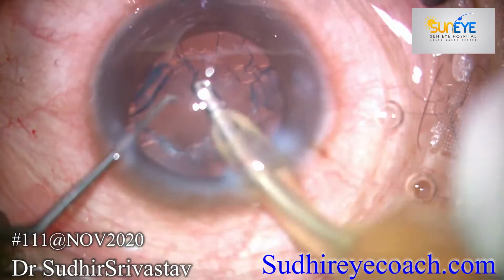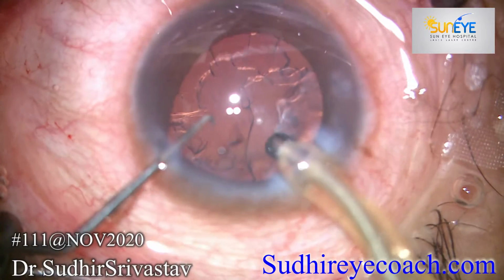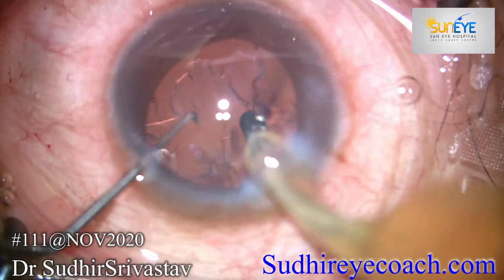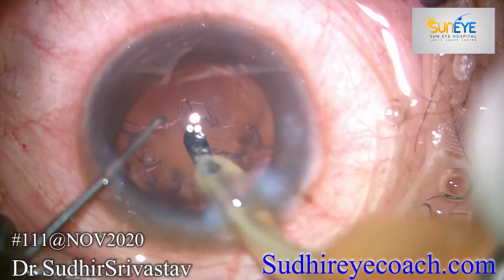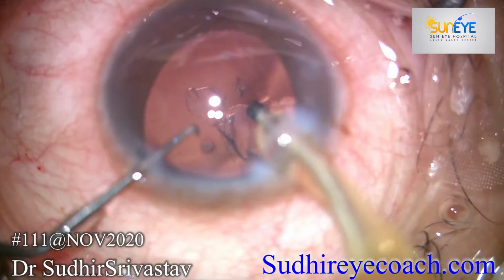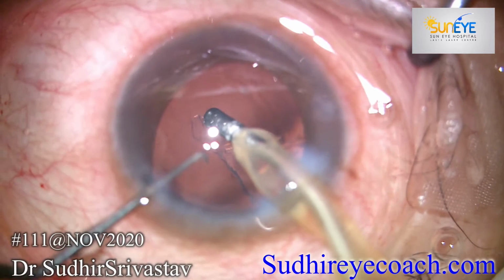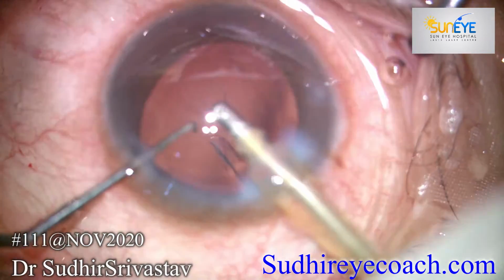In a high myopic eye, always remove the epinucleus plate and the cortical matter very carefully. This is the time when maximum care should be taken not to hold the posterior capsule with the irrigation aspiration tip. A high myopic eye has degenerated and liquefied vitreous, and the posterior capsule is also thin and more mobile.